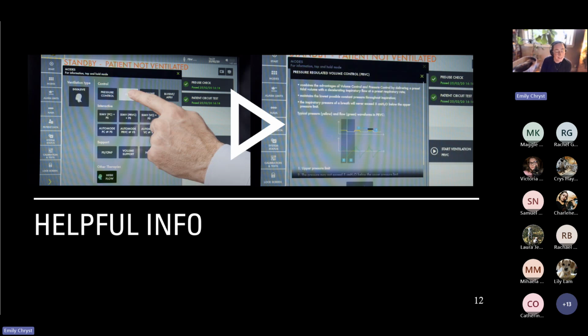these parameters mean. You can press and hold those parameters. I would encourage you to do this as you're practicing with your ventilator. I think of this as kind of like CPR, where Recover says you need to practice every 6 months to stay on top of it, because when we need to do CPR, we need to be an expert, but we don't do it that often, right?